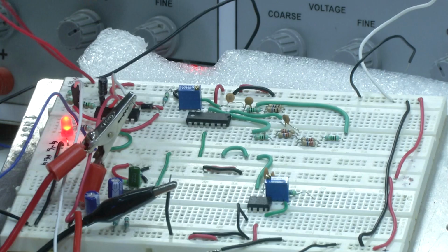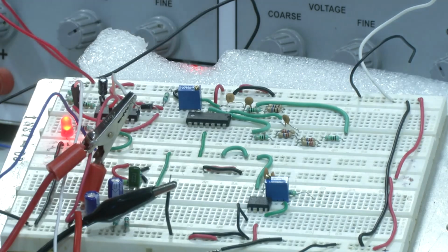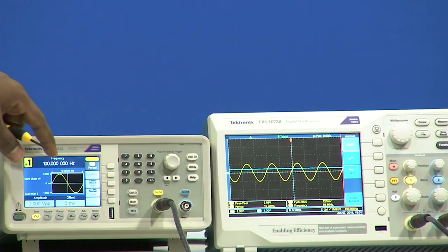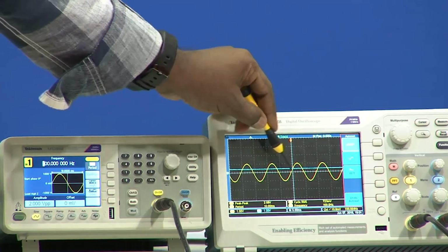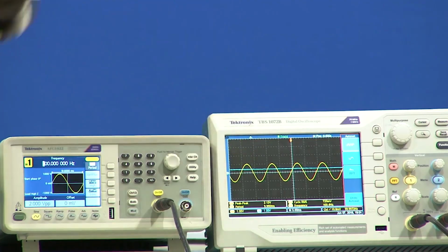So we have connected an output at this point, which is the combination of 1 mega and 2 mega resistor. So at the node of 1 mega and 2 mega, we have connected the output. Here if you can see, we have applied an input frequency of 100, amplitude peak to peak value of 2, that means peak value of 1 volt. Now when we see the output, the yellow represents our input, and the output is in blue color, right.